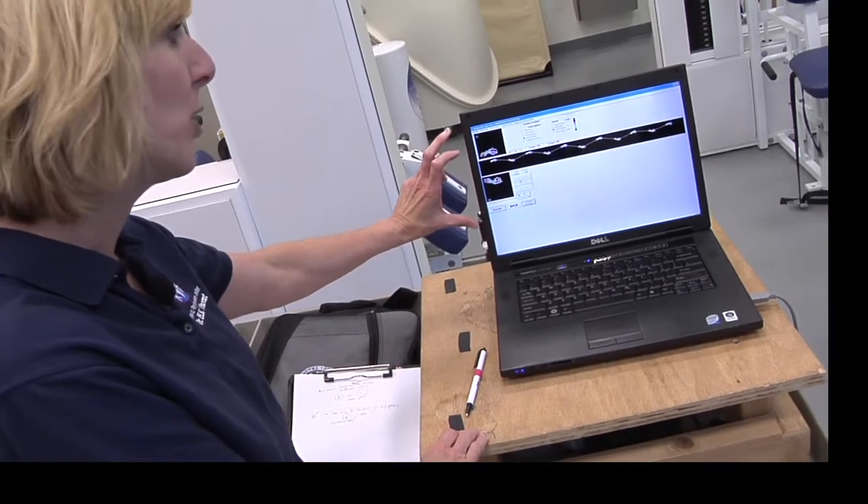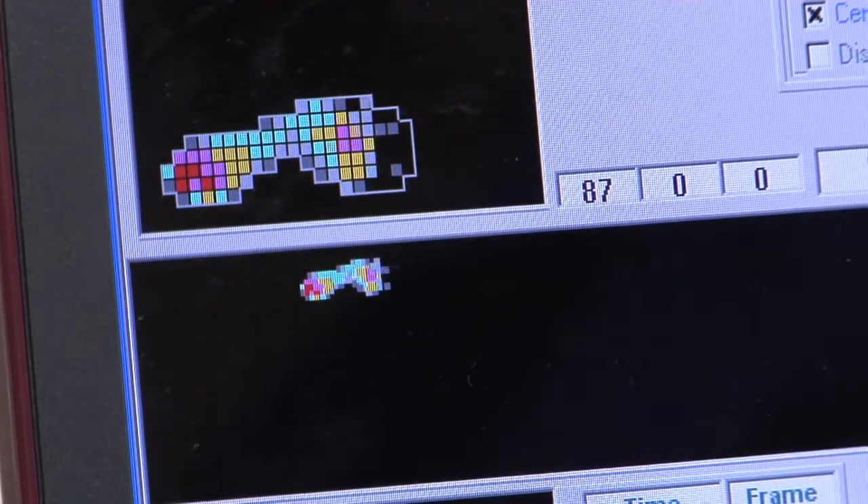We also provide you with examples of your foot pressures as you move across the mat, so we give you an idea of how you're moving but also your foot pressures, which can be very useful if you're going forward with exercise plans or shoe selection.